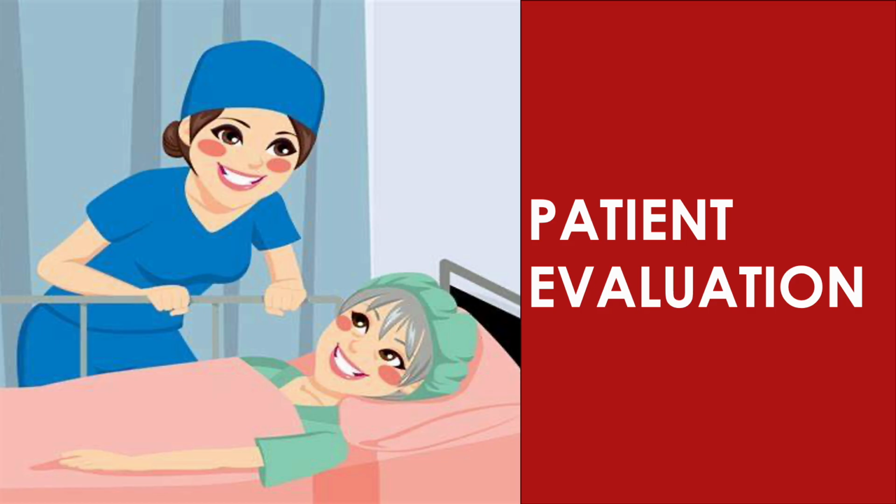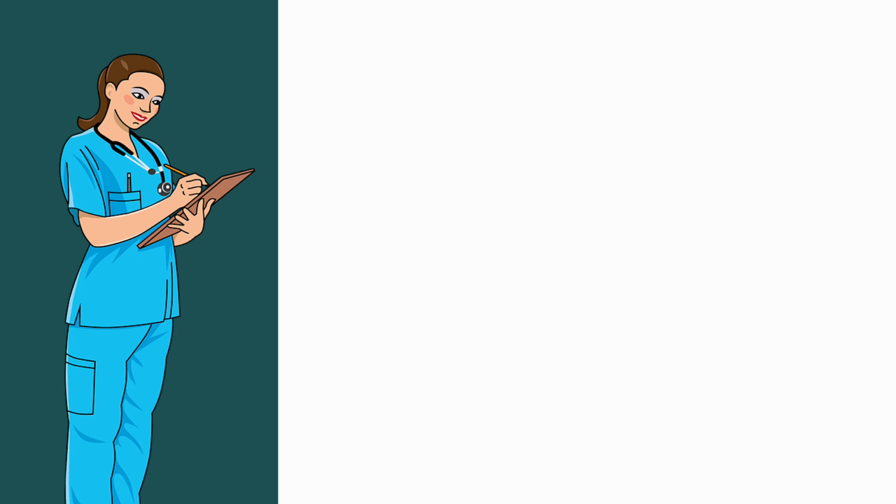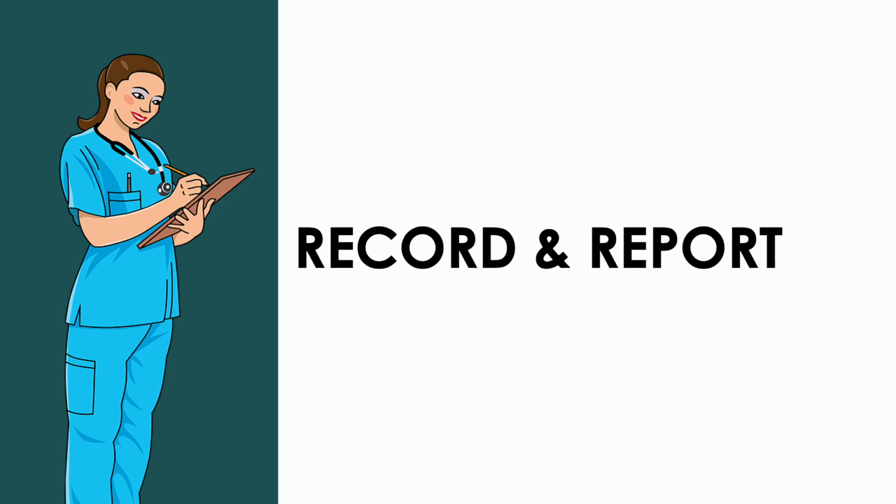At this point, it is still very important to keep on assessing the patient's condition to check if they are still okay or need anything before you finish your procedure with them. Using the control chart form, record the temperature, pulse, and respiration to ensure continuity of care, and also record in the patient's progress report any findings that you have found. Once done, do not forget to go to your registered nurse to report any abnormalities.